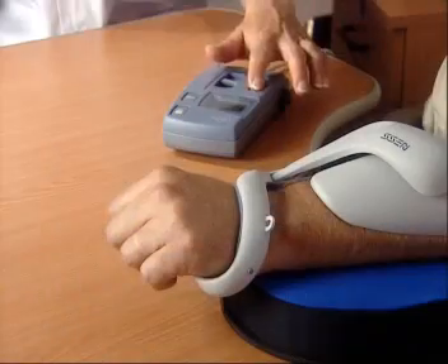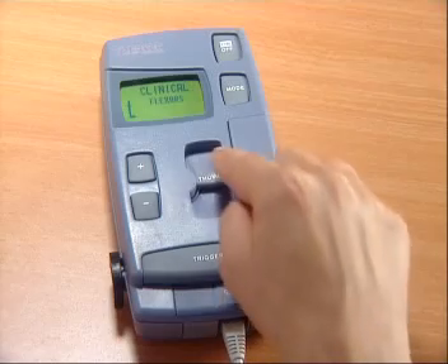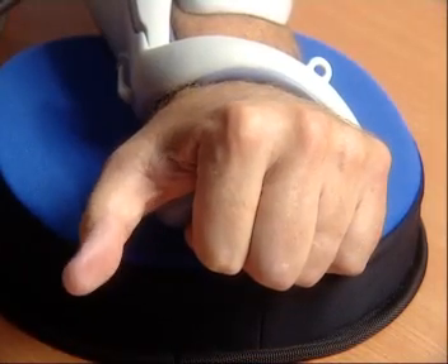The control unit enables easy programming of functional modes and training regimes. An ergonomic, intuitive interface gives the clinician or patient simple control of desired hand activation.